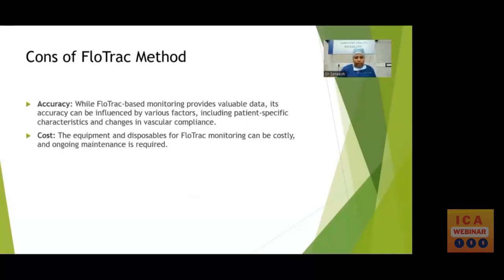Cons: while FloTrac monitoring provides valuable data, its accuracy can be influenced by various factors, including patient-specific characteristics and changes in vascular compliance. The equipment and disposables for FloTrac monitoring can be costly, and ongoing maintenance is required.